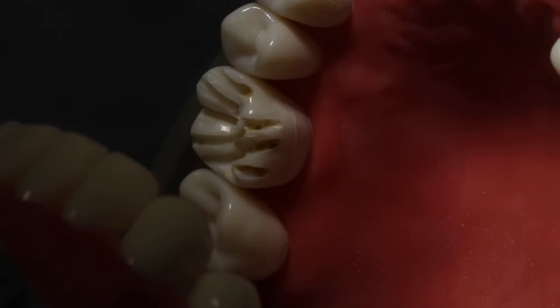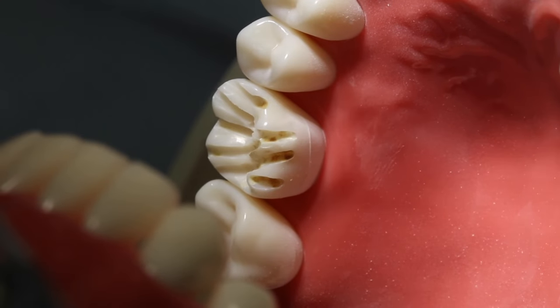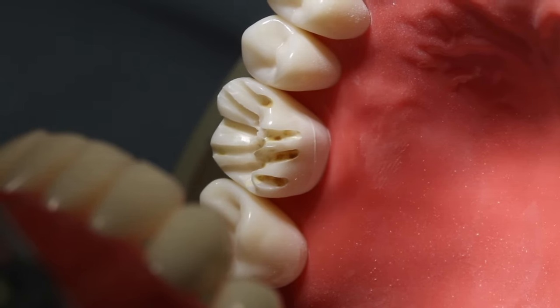We'll change burrs because this one's getting pretty dull. Okay, so there's all of our guide cuts, and now we're going to connect them and try to make some sense of our occlusal reduction.